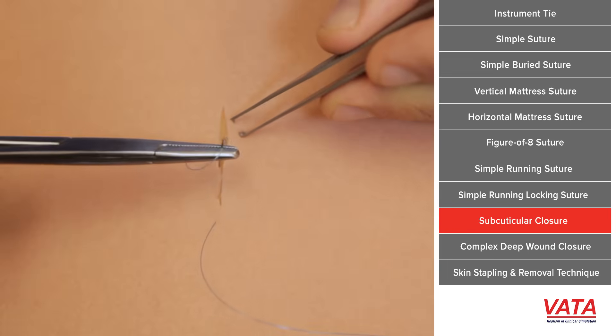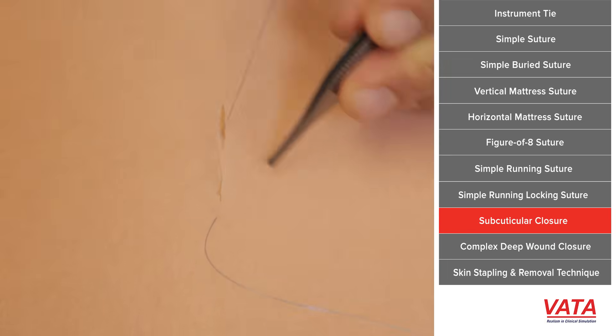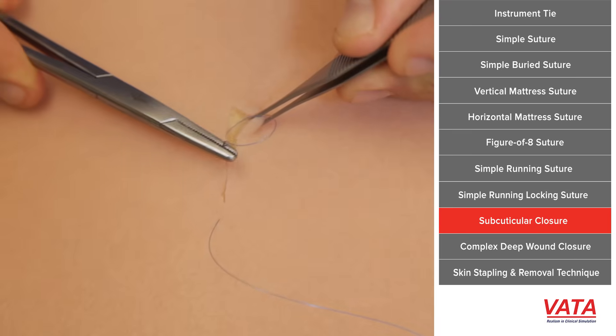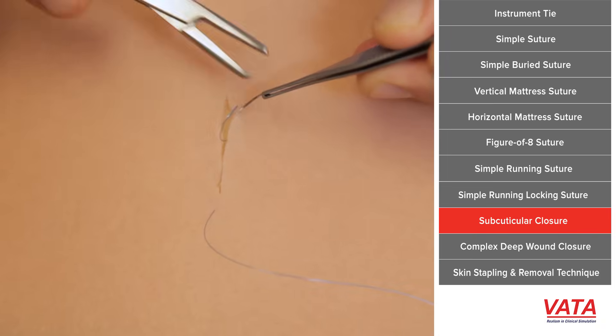What you see is I'm pulling the suture across to show where the next stitch should be, so I make sure there's no bunching. Over time you'll find that it really doesn't matter how much you advance as long as you're doing the same amount each time.